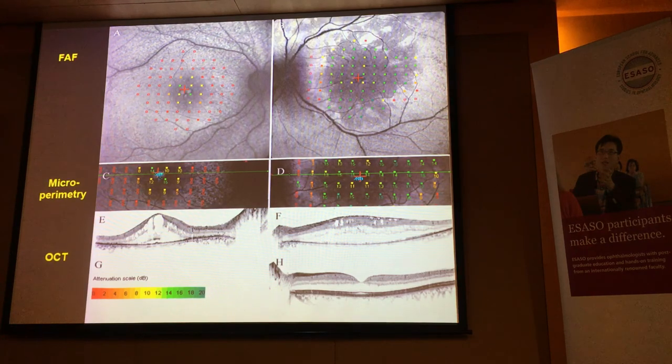And of course, if you've got cystoid macular edema, that is not affecting photoreceptor function in that area. It's just elevating the photoreceptors. So the photoreceptors can still phototransduce. They've still got sensitivity. They've still got measurable visual fields. And that's why if you want to do research on cystoid macular edema in diabetes, do not use a multifocal ERG, because you won't find it, unless you've got associated macular atrophy.